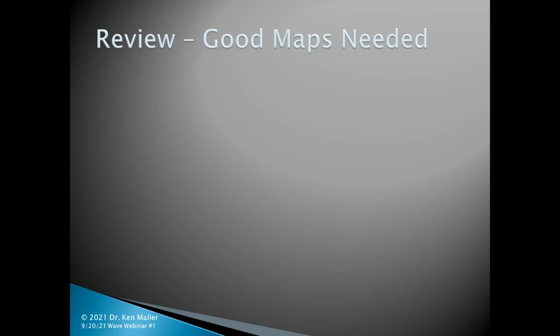However, this particular eye that showed the skewed capture point is an eye that best corrects to 20/400. The bar is very low for me to get a lens on that eye. So I said, just as an exercise, let me design a lens from this data that I feel is tainted. And so I went ahead and designed up that lens and put it on the patient today. And that lens had to be the absolute worst fitting lens I have seen behind my biomicroscope in at least the last 10 years. That's how poorly that lens fit.